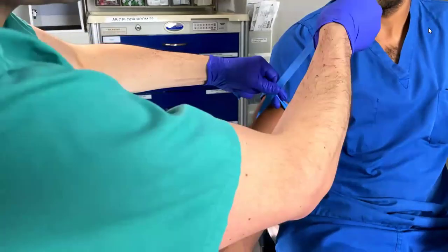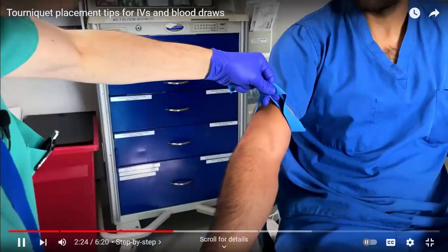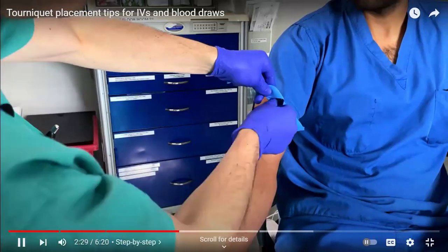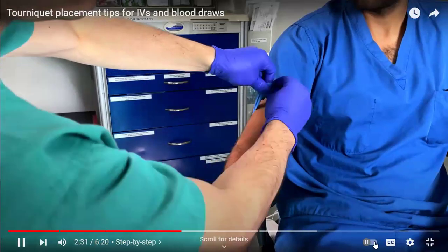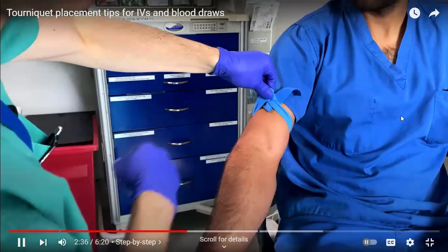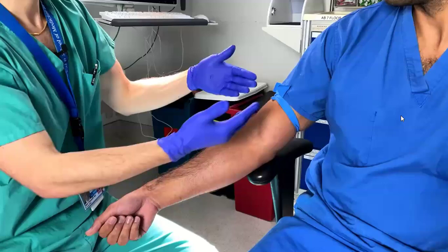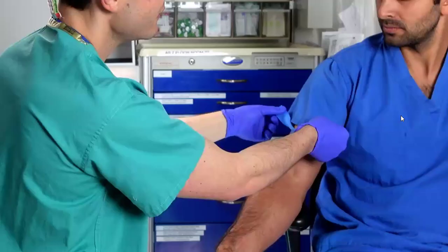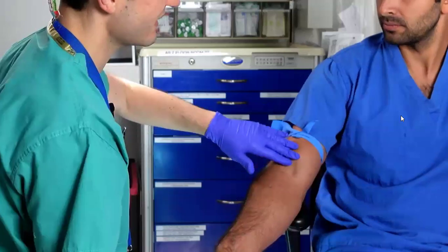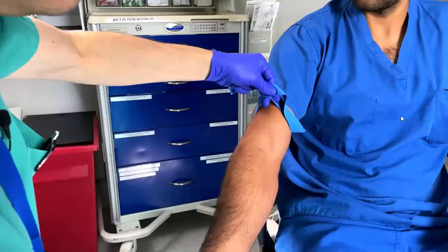I simply pull up like this, and then I can maintain that tightness using my thumb and index finger on my left hand. Once I've gotten to the desired level of tightness, I can go ahead and tuck this in underneath this loop here using my right hand, and that maintains the level of tightness. I also want you to appreciate that that keeps both ends facing away from the area where I intend to do my venipuncture.